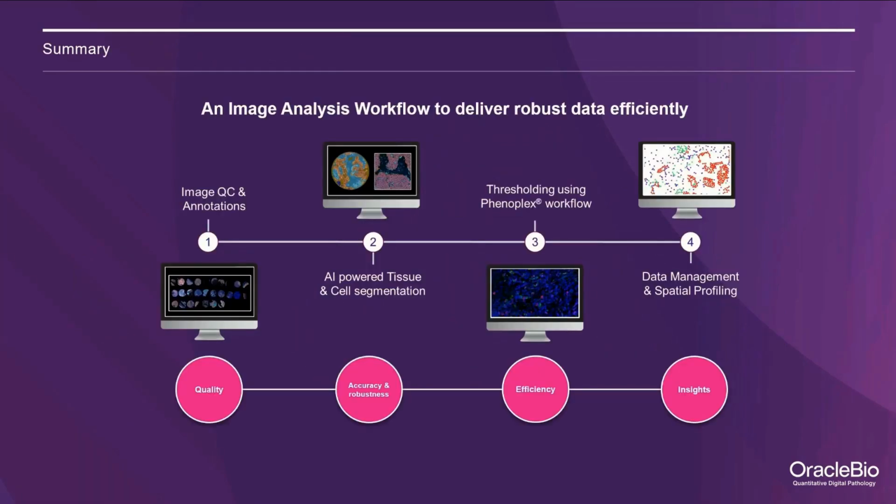So to conclude, I've given an overview of a standardized image analysis workflow that combines data-driven image quality assessment, IA scientist and pathologist inputs, the power of AI deep learning, utilization of Visiopharm PhenoPlex module, and downstream data processing. And together, this has enabled us to interrogate complex pathologies within high-plex staining panels to deliver quality data from valuable tissue samples in an R&D setting.